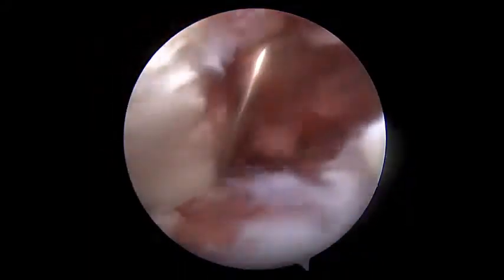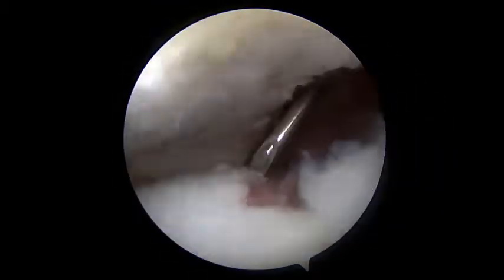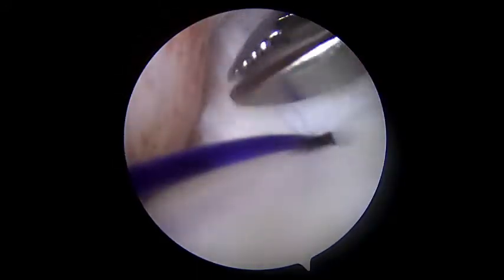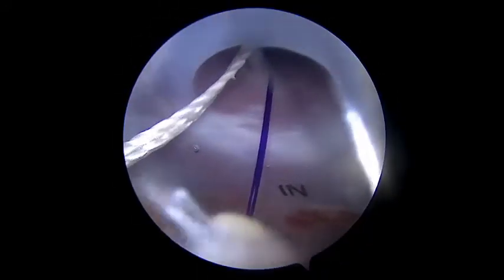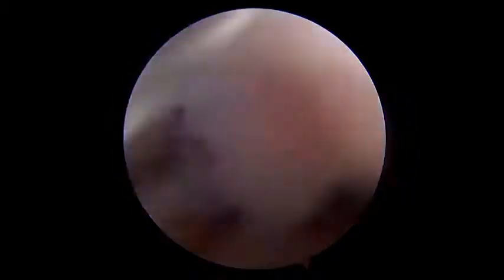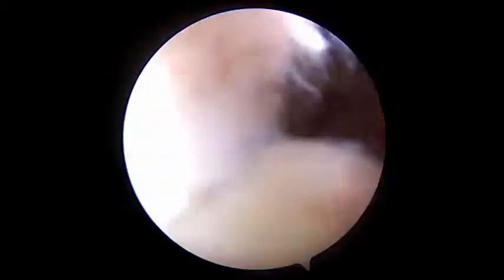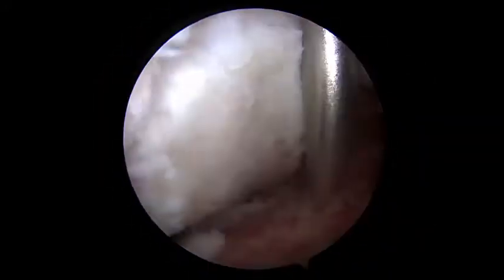The 0 PDS suture is then utilized to shuttle labral tape. This series of steps is repeated, and a 0 PDS suture is placed at the junction of the upper 1/3, inferior 2/3, and labral tape is once again shuttled. With the 2 labral tape sutures, adequate control of the subscapularis tendon is achieved.